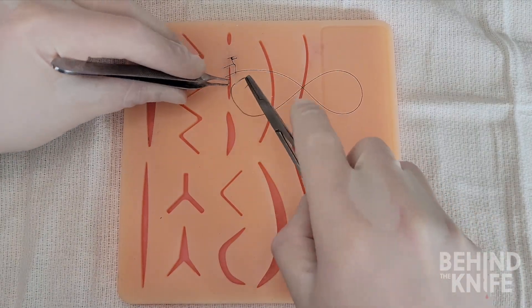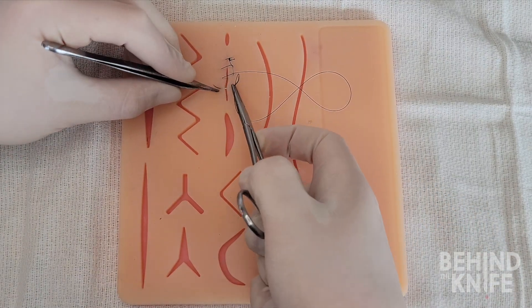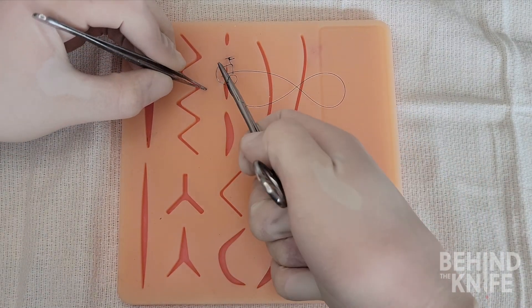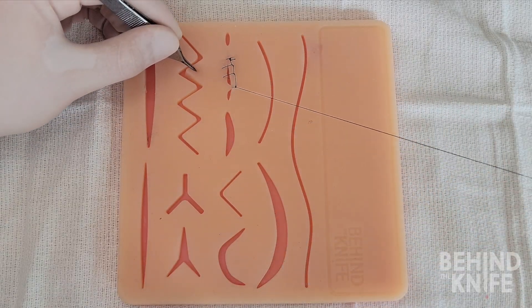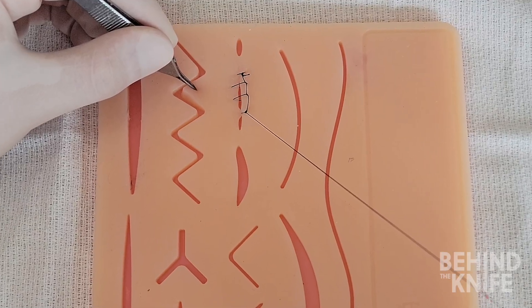You will continue this until you reach the end of the wound and then we'll finish this technique the same way as I've demonstrated in the prior non-locking simple running suture video. And that is how you perform the locking variation of the simple running suture.